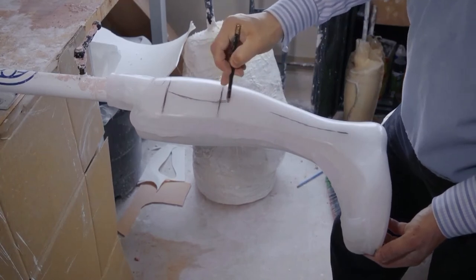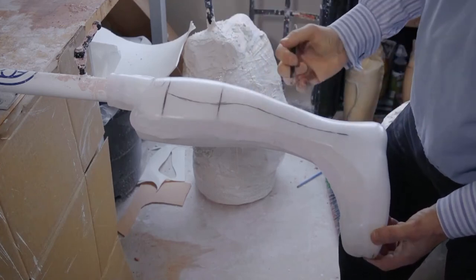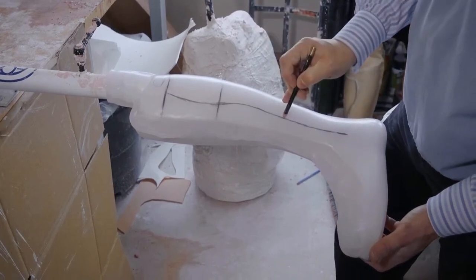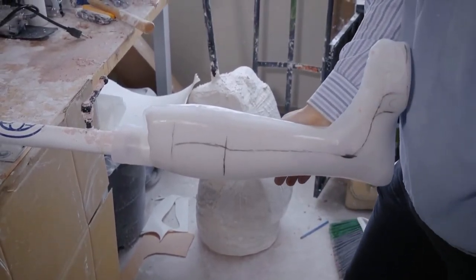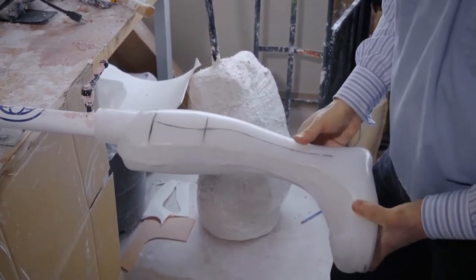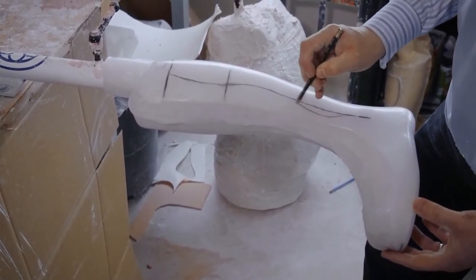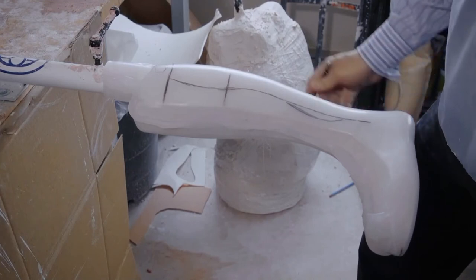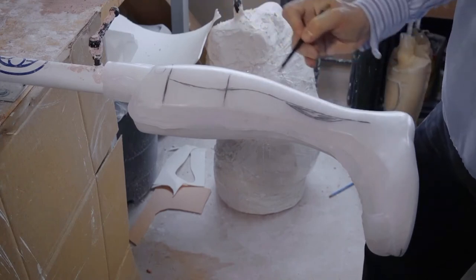And then we're slowly connecting our lines. Okay? Now, this is just a straight solid AFO. If there's going to be a lateral tab here, if you can remember my hand being a portion that's trying to steady the leg here, and then this right here is something holding the leg straight, we would add on that lateral tab. Some people call it by other names, but we'll call it a lateral tab, and that would just be something extra that we're doing to control varus and valgus alignment. Okay? So that would be the add-on that we would do. And we'll show you that more on the patient.